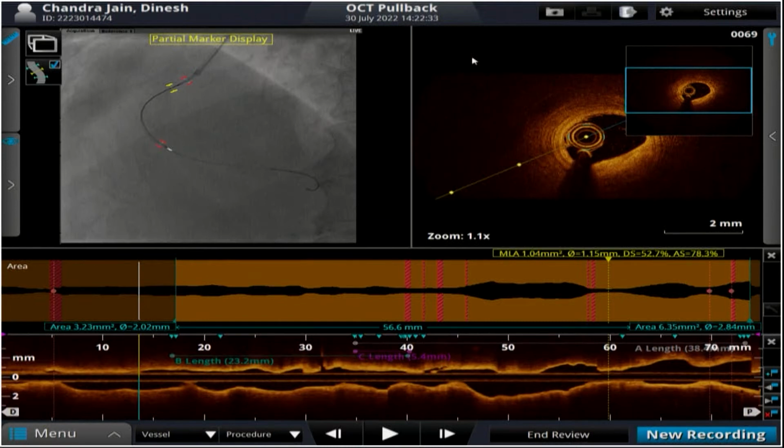So Brian, sir, for saline, do you use the injector to inject? No, I use my hand, sir.